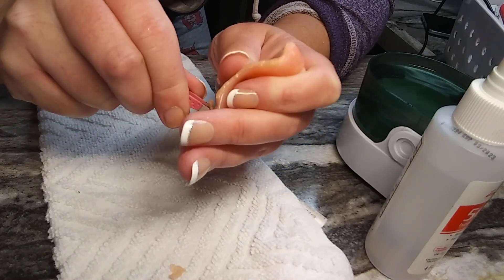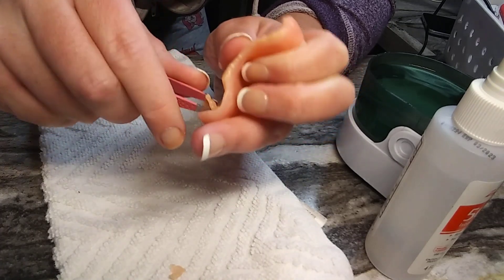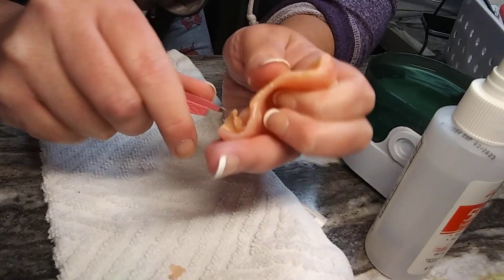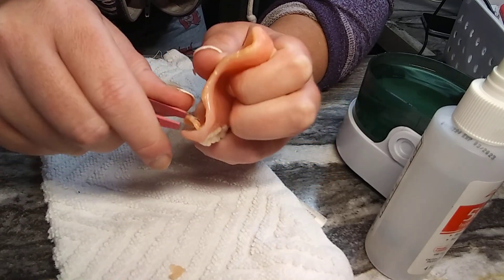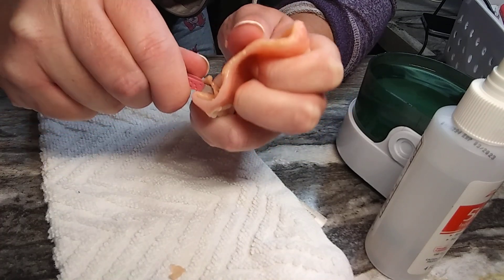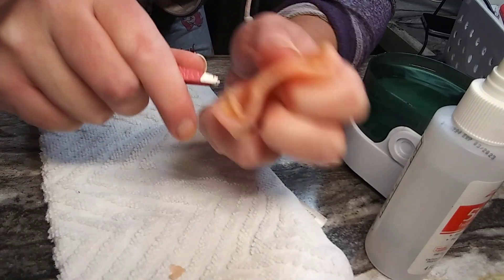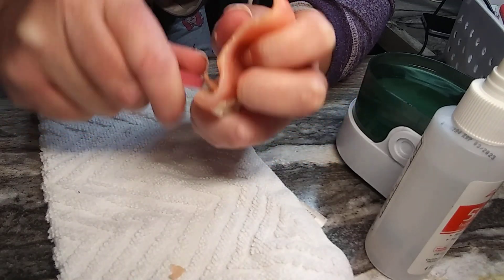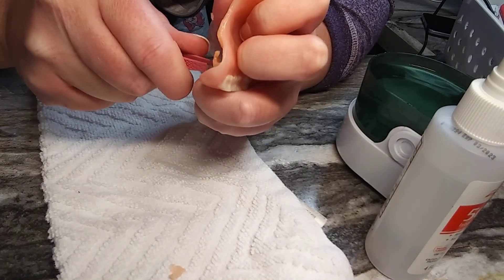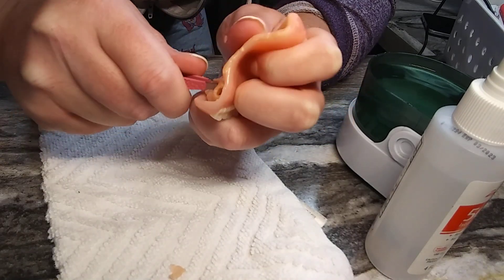I noticed it was starting to lift and the reline was actually starting to dry out on the edges, so I was like, alright, time to do it again. Tomorrow — because it is nighttime right now — I'll probably do the reline, which I've done a video on before, but I'll do it again. All you do is pinch-pull, pinch-pull, pinch-pull. When it's too hard to get out, stick it in hot water — it'll soften the reline.